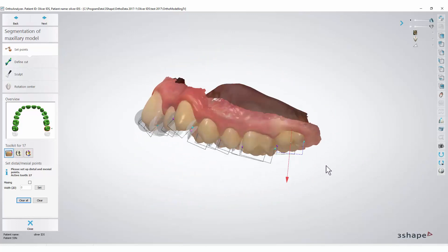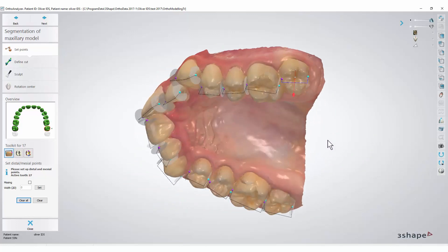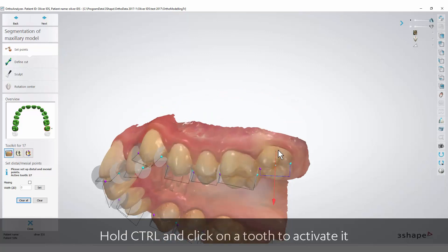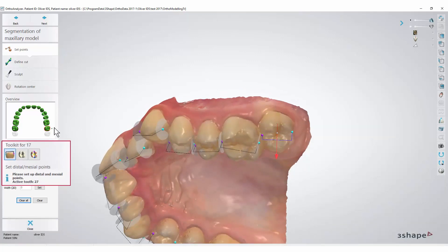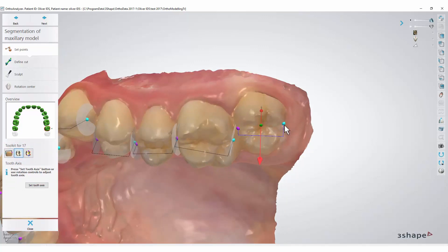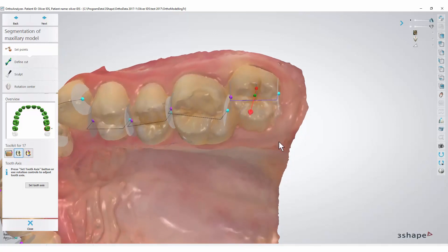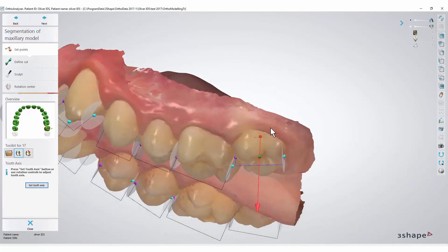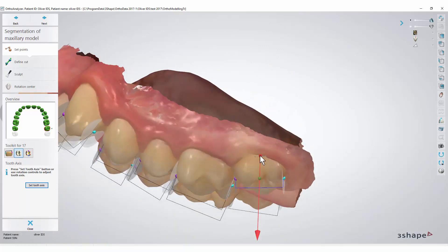After you finish, go through each tooth, look at the points you've set and examine the directions of the root axes. To activate a tooth, you can also press the Control button and click on it. To edit points on the selected tooth, press the tooth axis button in the left toolbar — this gives you the option to move them. You are also able to set the root axis direction perpendicular to the 2D plane you are examining. Simply press Set Tooth Axis and the direction of the root will be altered.